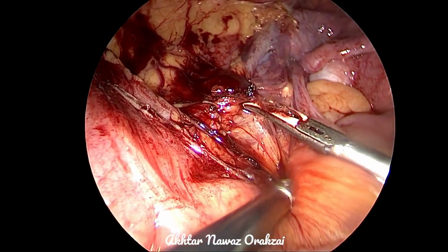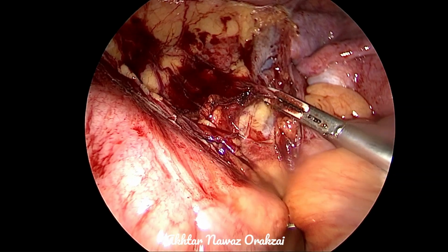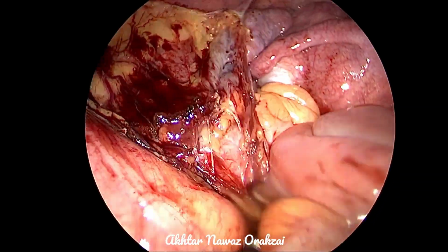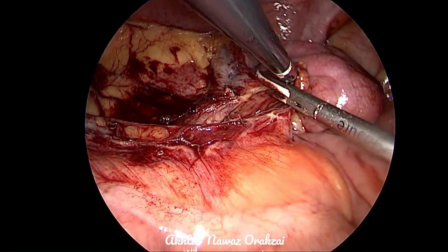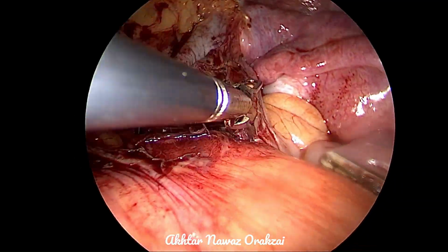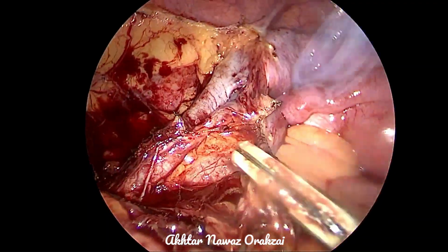But the essence is to keep the field as much blood free as possible, because discoloration of all the things into red will make it difficult to identify the ureter, and then dissection will also be a little difficult.